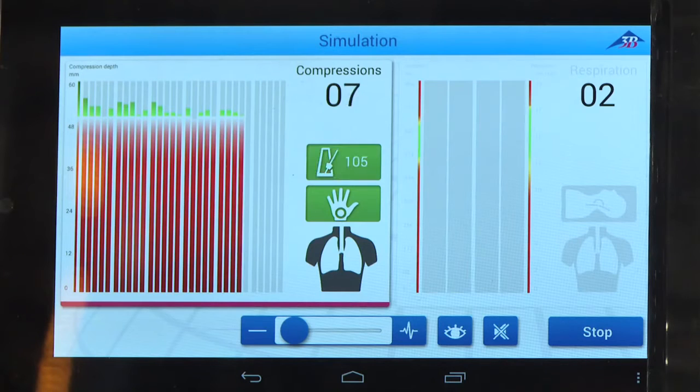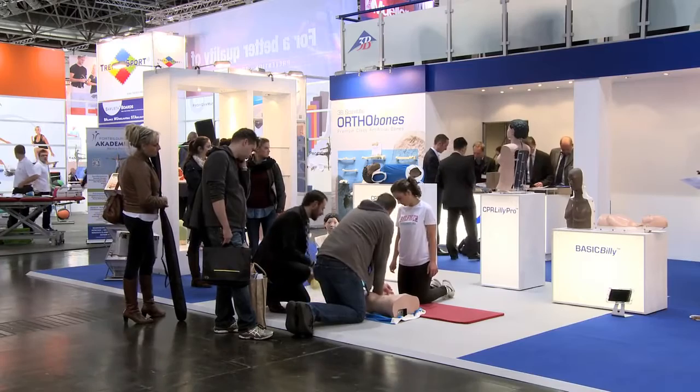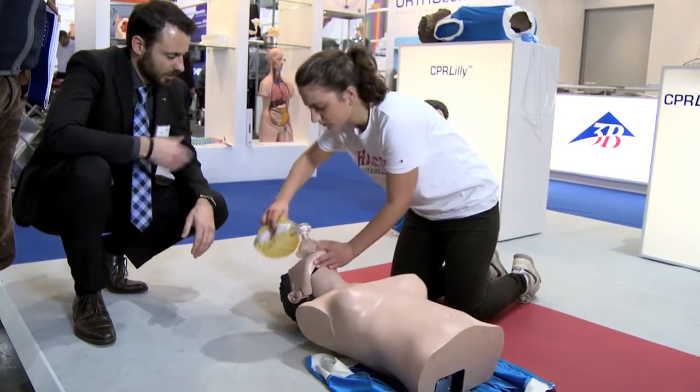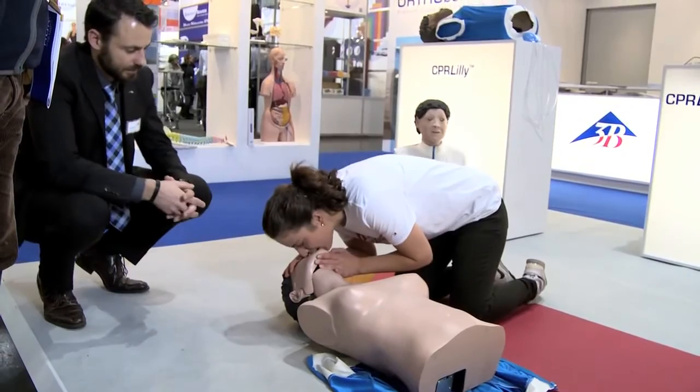The system is ready to work and the wireless connection allows for high flexibility. The CPR Lily Pro works with a two-chamber airway ventilation system, which is easy to use and guarantees high hygienic levels.